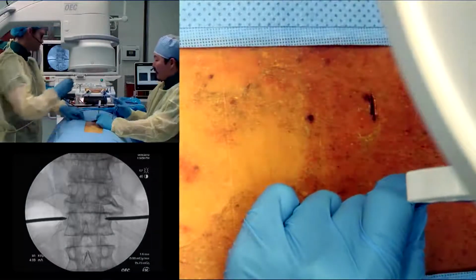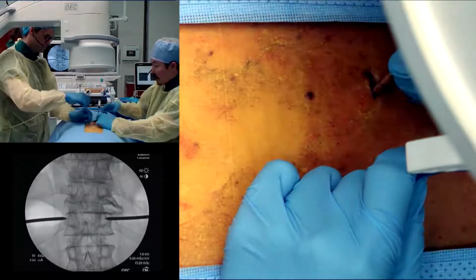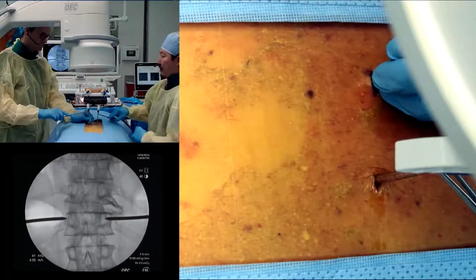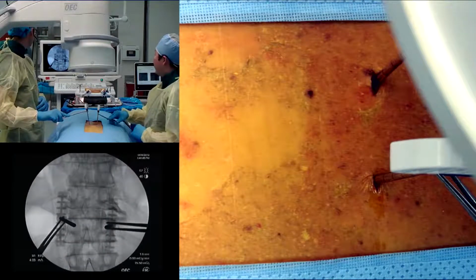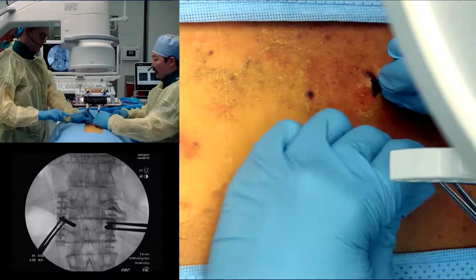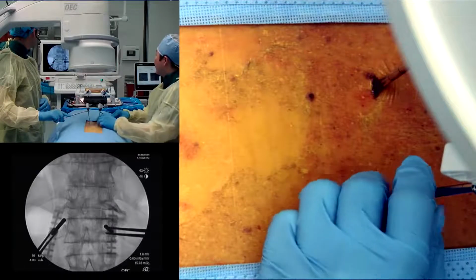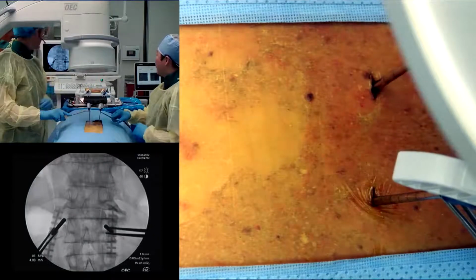And what we're going to do is I'm going to try to envision the coaxis of this, and then we're going to try to get to a bony surface. Picture that. Okay, so if you take a look at that picture right there, I'm too medial. Zane, you're looking pretty good. Maybe be a little bit more cranial. Go ahead and picture that. Maybe just go a little bit more cranial and a little bit more lateral. And more lateral, yep. Picture that.